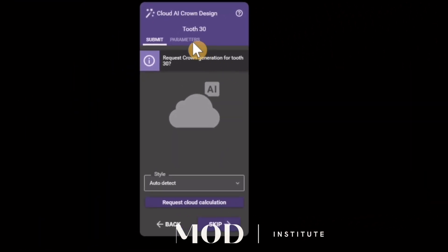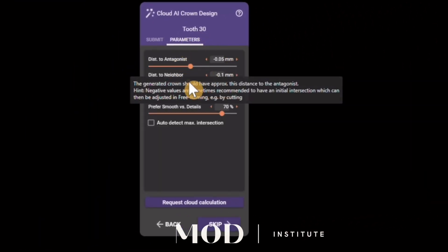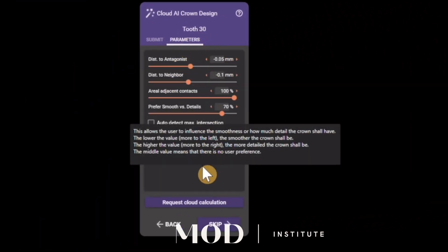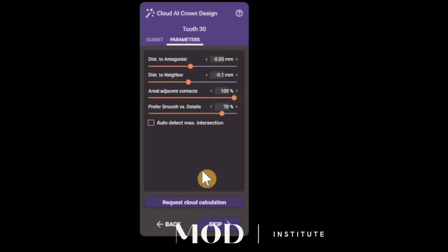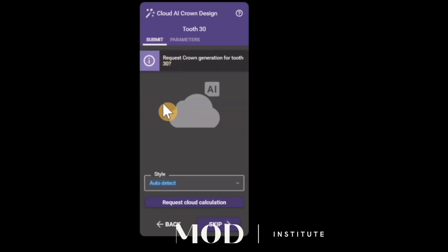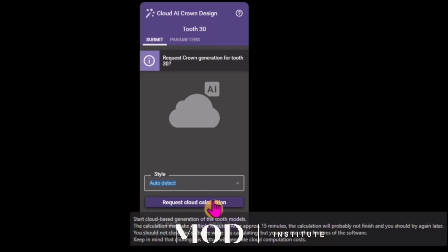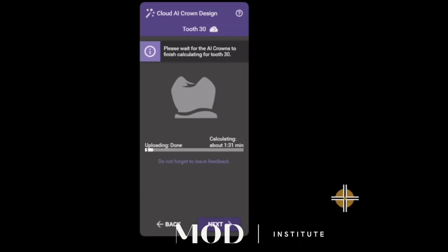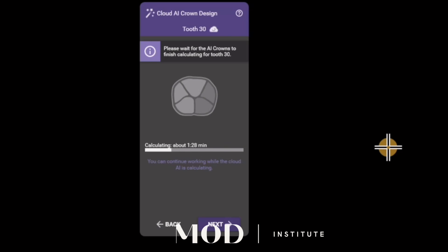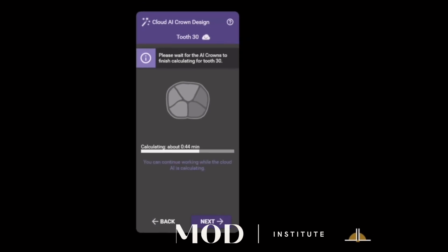In the Parameters tab you can customize to whatever you want, but I find there's absolutely no need to change anything. Go ahead and hit Request Cloud Calculation and in about a minute and 30 seconds you'll see things happening behind the scenes — it puts in a tooth, adapts the tooth, and all that cool stuff.